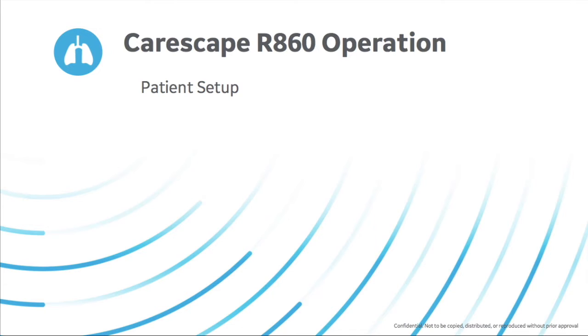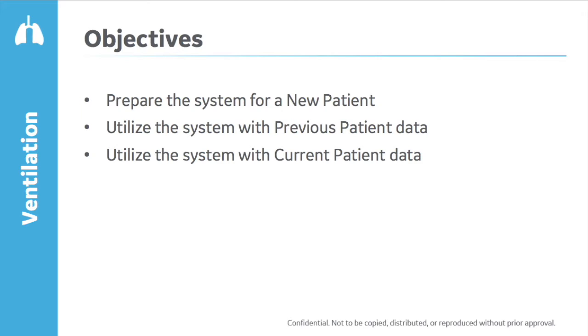The CareScape R860 operation, patient setup. After watching the video, the viewer should be able to prepare the system for a new patient, utilize the system with previous patient data, and utilize the system with current patient data.